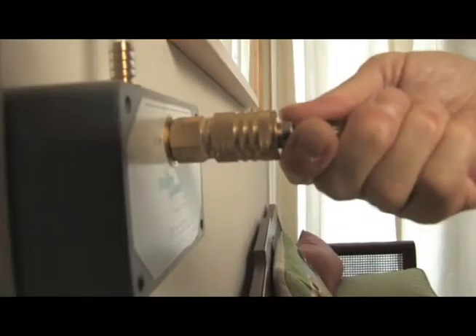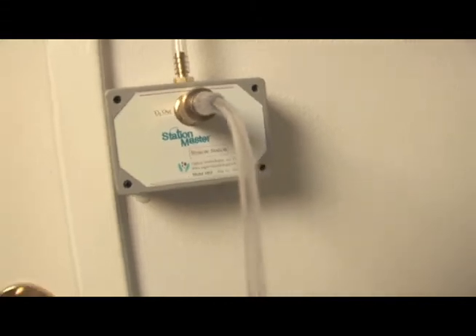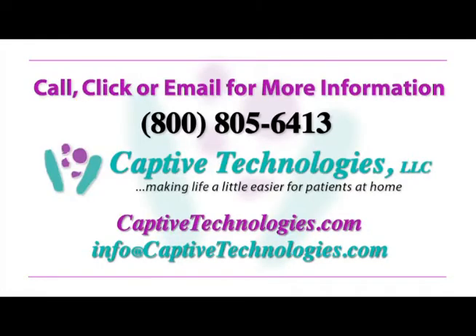StationMaster's quick connect couplings just take a single push for you to connect or disconnect and move to another convenient outlet. Oxygen flows only when you're connected, so take back the enjoyment of everyday living that you deserve. Order your StationMaster today and be free of that tangled 50-foot oxygen tube tomorrow. Ask your oxygen supplier about StationMaster or call 800-805-6413 for a StationMaster provider near you.